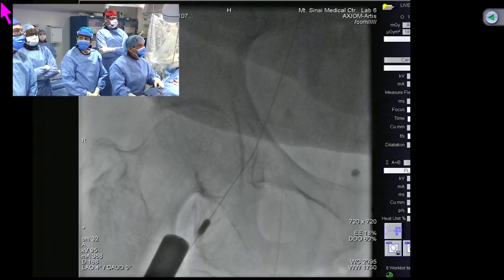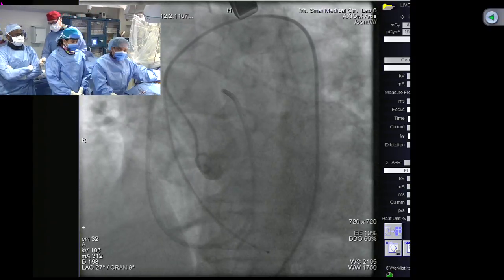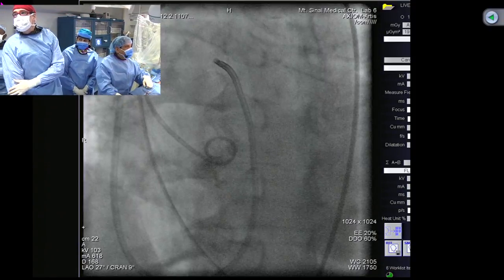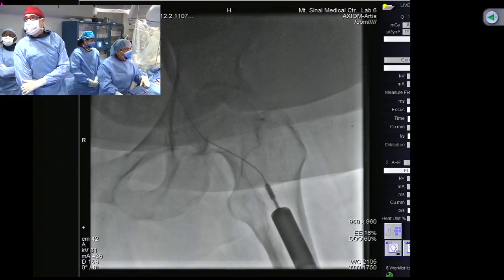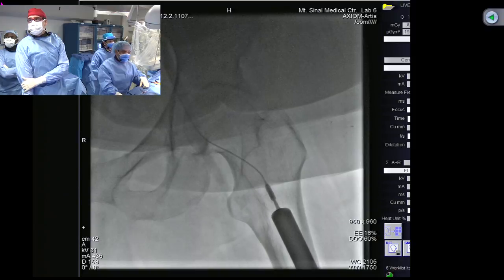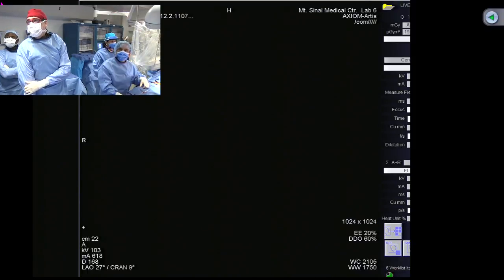So we go to puncture here, same. It's percutaneous. Do you want to talk through, which kind of sheath? Just to show you quickly the access, we went with a micro access here in the left side. The left hadn't been touched before. There'd been some cath through the right, so we chose the left because it was less scarred. Got nice access with a micro catheter.